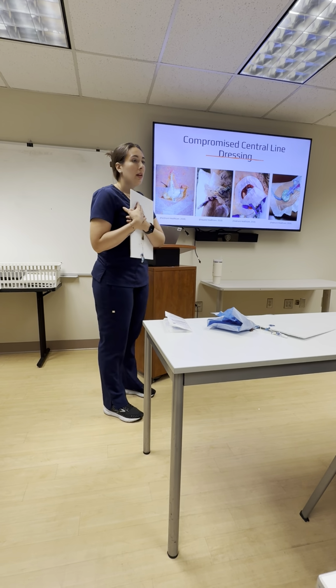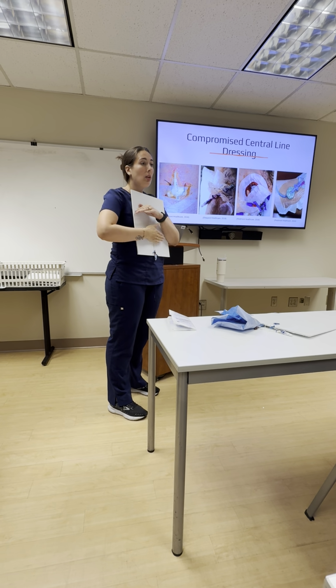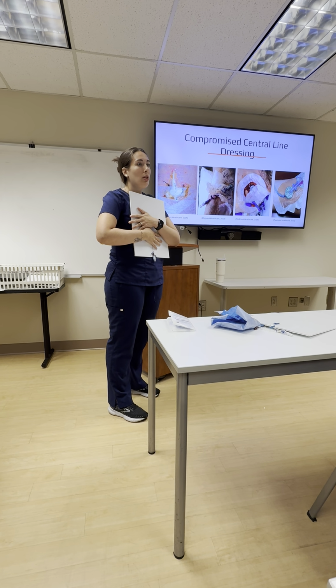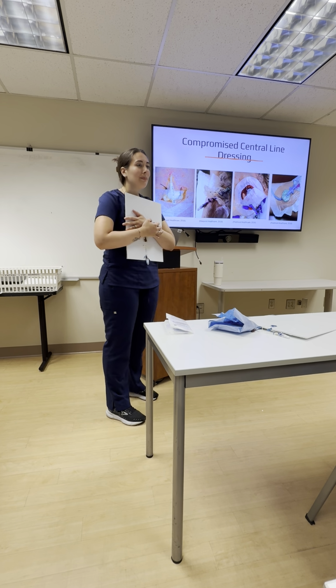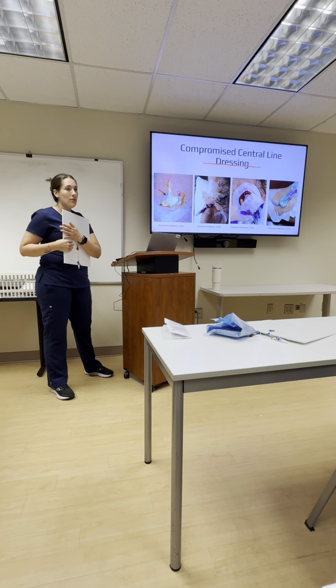For the one that's bleeding, would we apply pressure to stop the bleeding? Yeah, you can. Sometimes you'll see gauze, pressure. There's a lot of different devices if it's really bleeding a lot, like pressure bags. But that's if it's hemorrhaging. If it's bleeding a little bit, then we'll probably put gauze. Okay.